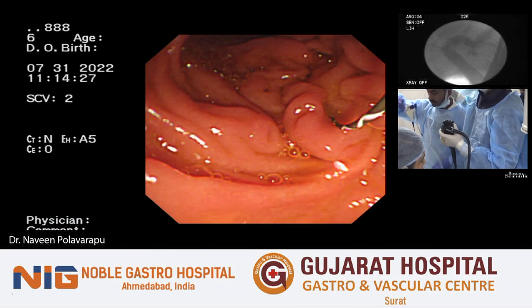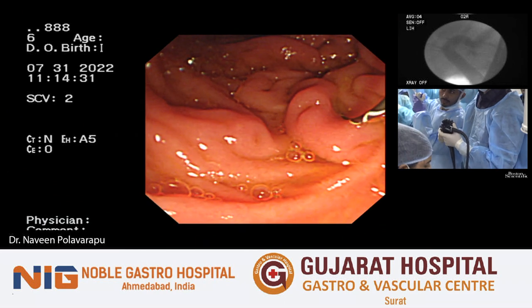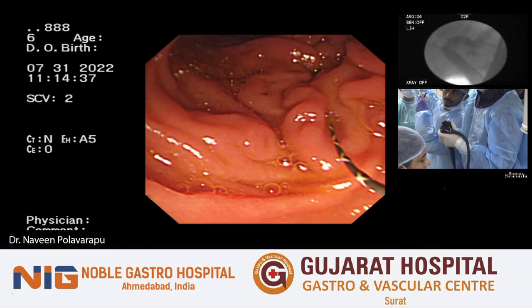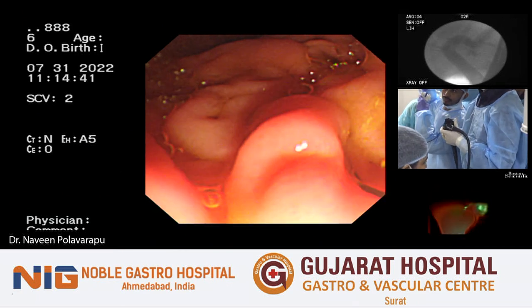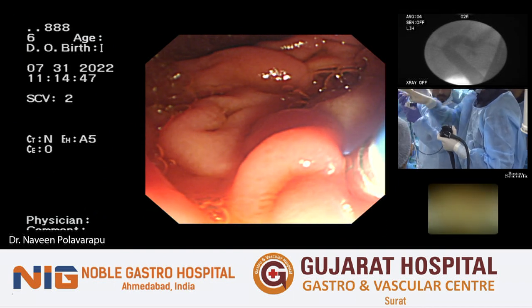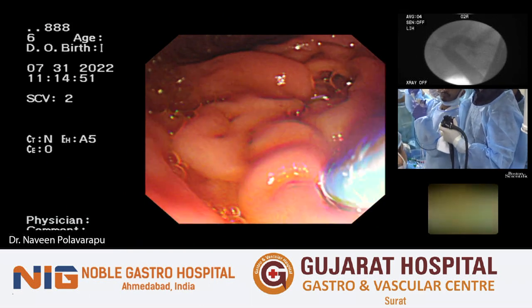Just a bit of attention on the wire, please. Yeah, good, keep putting the tension. Okay, I think I'm almost there. Can you get these 5 views, please? Okay, 8 minutes. Let me just get the spy scope in.